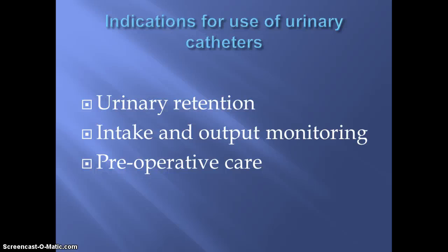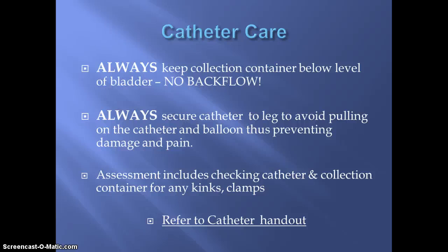Sometimes the catheters need to be put in. We may do them preoperatively. Again, you may see much more straight caths in the future for this.